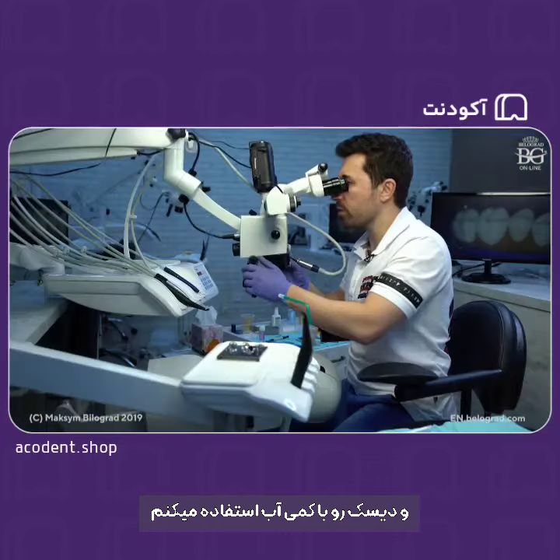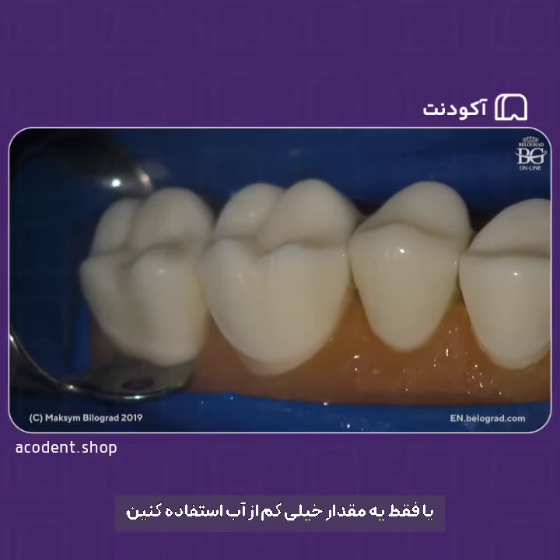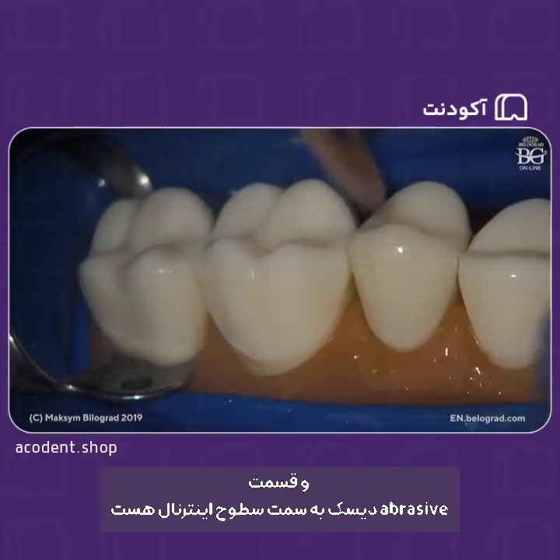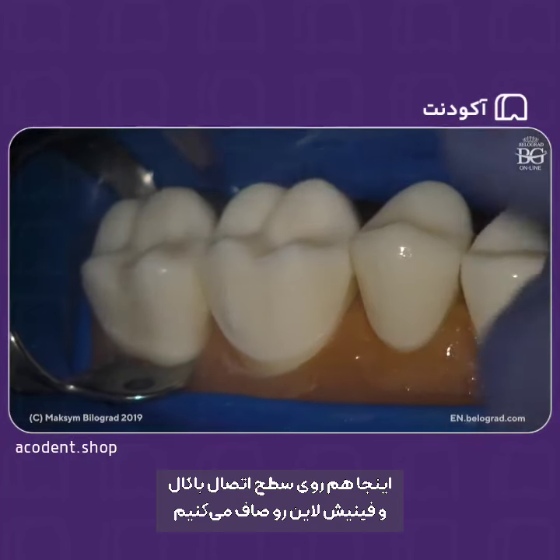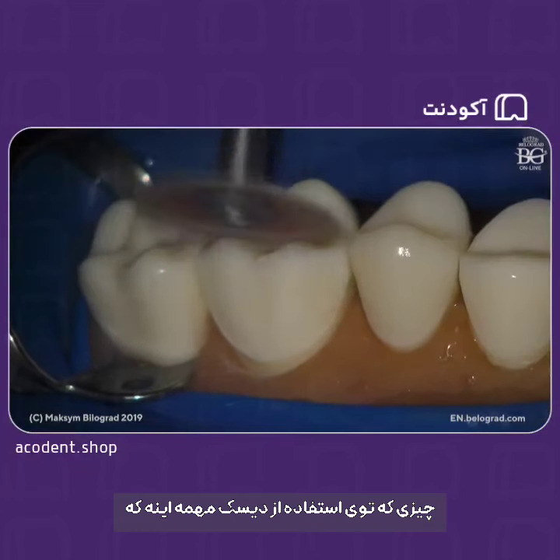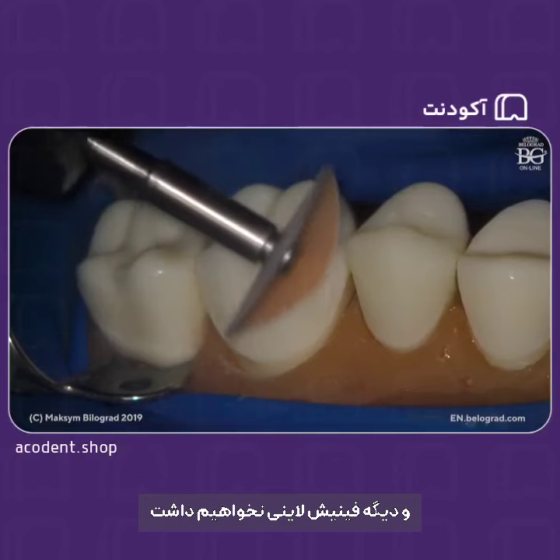I will take my disc with just a little bit of water, really little bit of water. We don't need too much. You can even switch off or just have it really little bit, 5000 RPM, and just the abrasive part of the disc is here, is internal, and just moving your disc over the surface, this transition from buccal surface and finish lines. What is important for disc is not to touch finish line. This is important, because if you will touch finish line with disc, there will be no finish line.